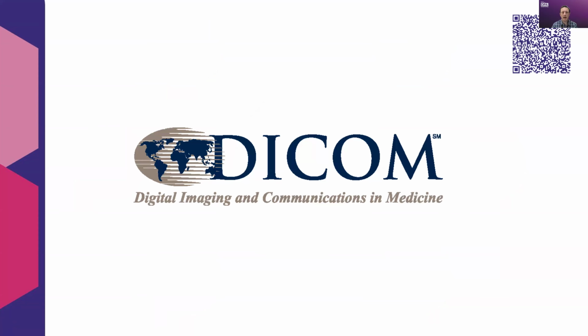DICOM, and I do have a few QR codes throughout here to provide some references if you're interested. DICOM was developed through partnership with NEMA and started with the American College of Radiology as a way to send information across in a standard way so that there was interoperability.